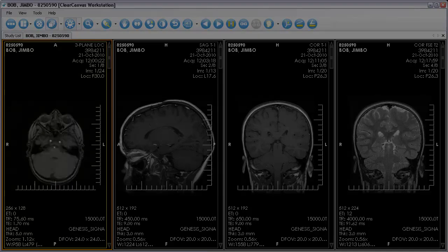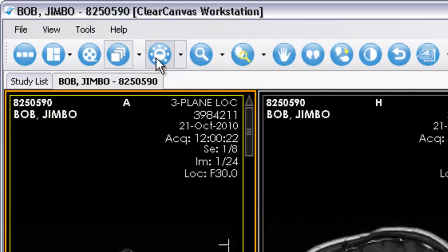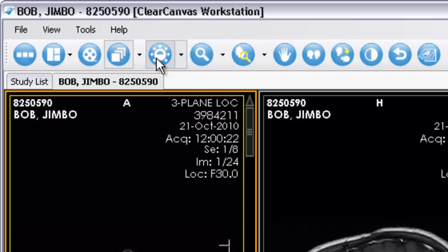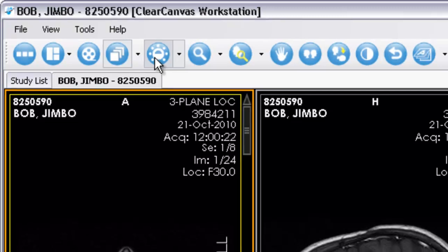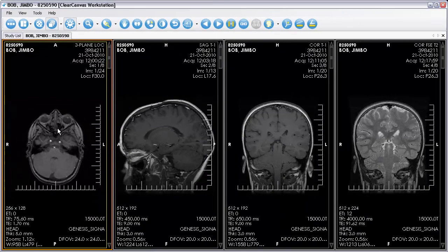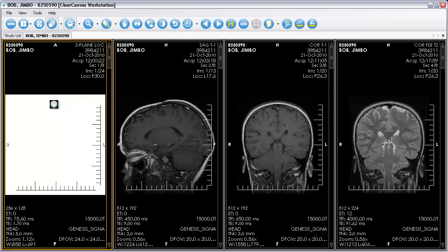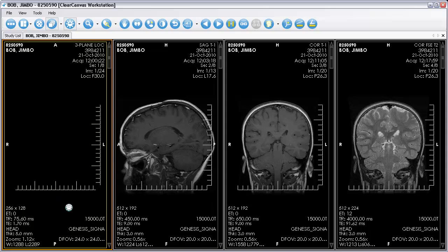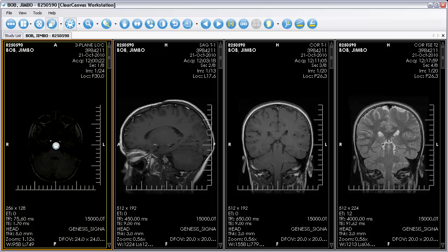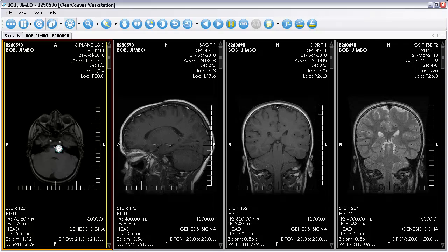You can change the brightness and contrast of the image using the window level tool. Make sure the window level tool is selected on the toolbar. Then hold down the right mouse button and drag the mouse around the image. Moving up and down changes the brightness and moving left and right changes the contrast.